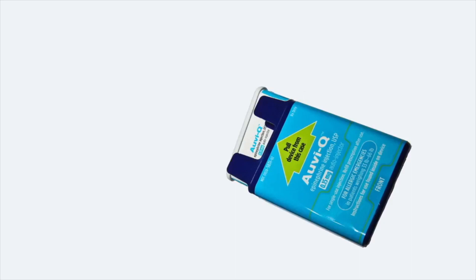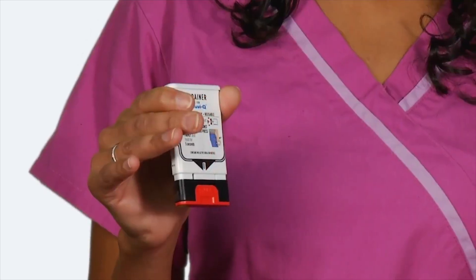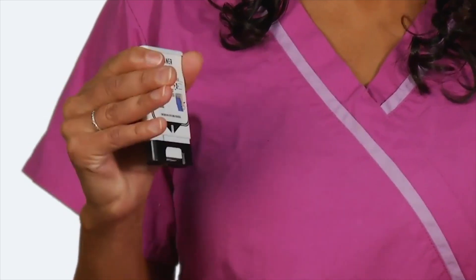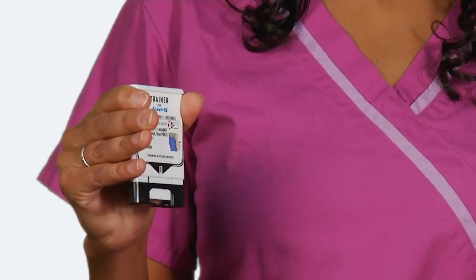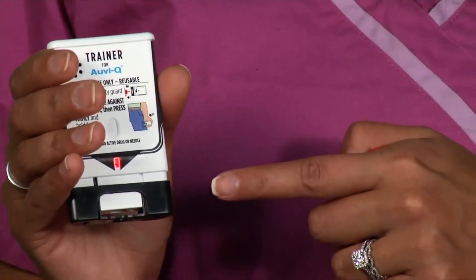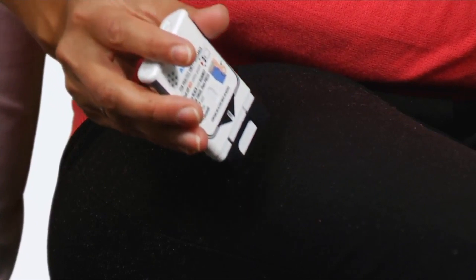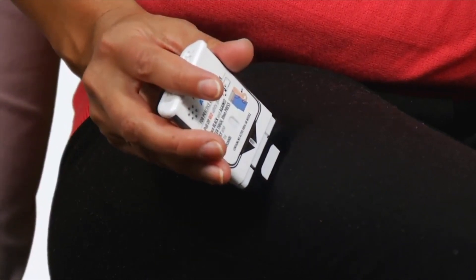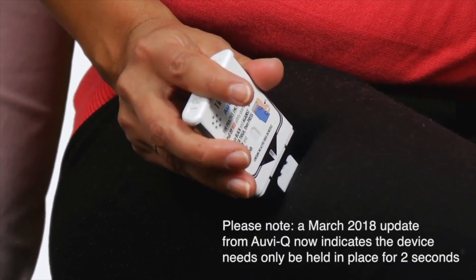To use OVQ, pull it from the outer case. Pull off the red safety guard — the safety guard is made to fit tightly, so pull firmly to remove it. Do not touch the black base, which is where the needle comes out. Put the black end of OVQ against the middle of the outer thigh, through clothing if needed, and press firmly.